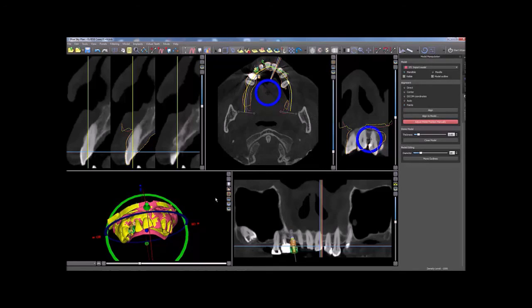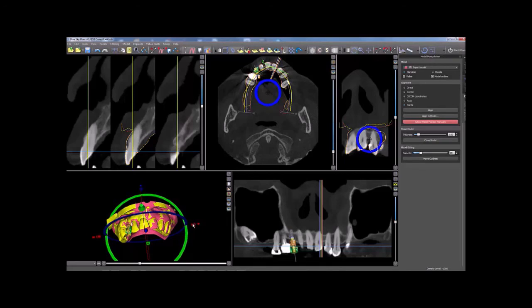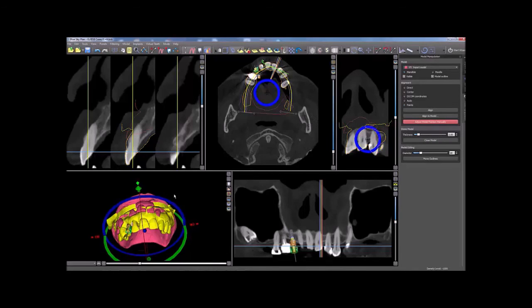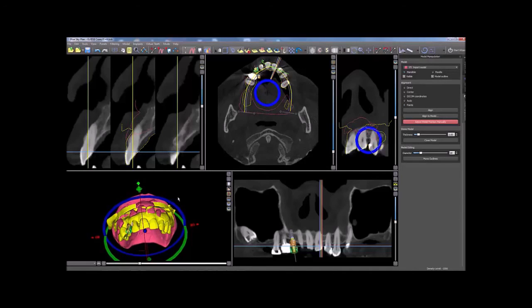The mouse can be used for coarse lateral and rotational adjustment. Click the mouse in the relevant view. For fine lateral adjustment, hold the Shift key and the four arrow keys on the keyboard. For fine rotational adjustment, hold the ALT key and click the appropriate keyboard arrow to achieve the proper rotation.